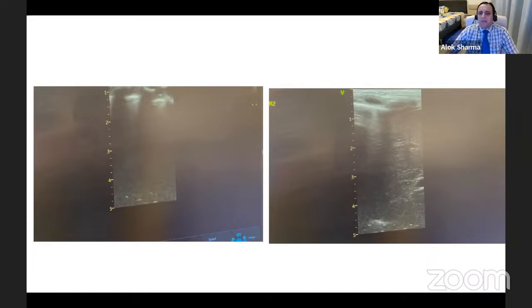You might, in my opinion, and you can on the GE, change the frequency from the preset setting. I have recorded a video again that I can share with you for the GE. On the bottom of the GE screen where you have frequency, the frequency would have been set at 8. That round button, you have to press it, and you can change the frequency from 7, which is your preset setting, right up.